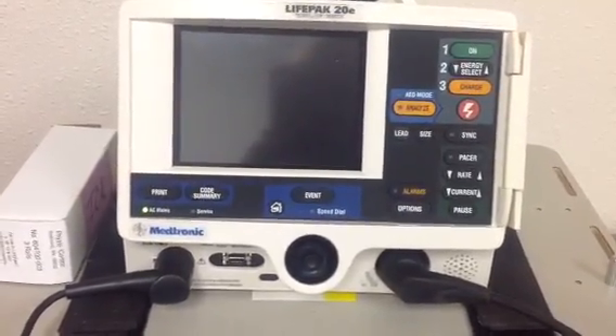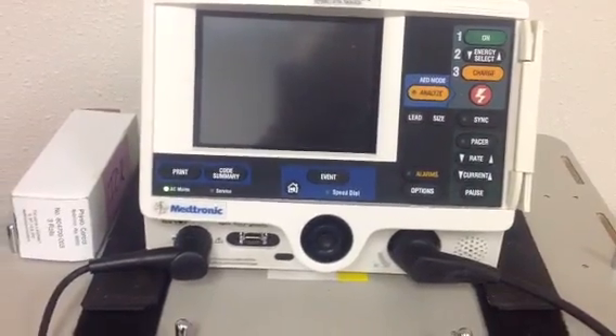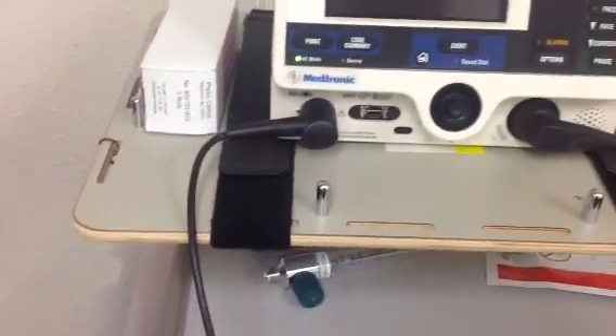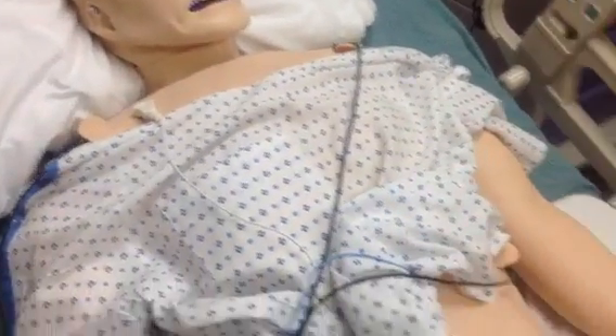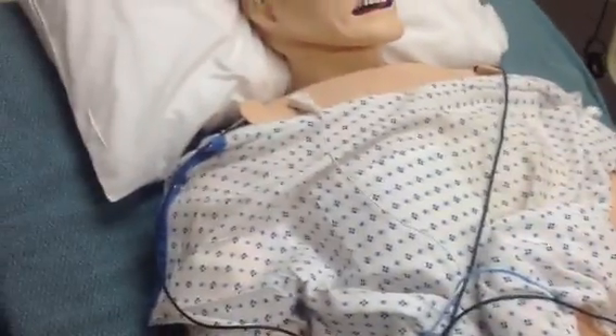First of all, you've got to connect the cables and there are two cables that have to be connected. One set of them goes to the ECG points and they are labeled left arm, left leg, and right arm.